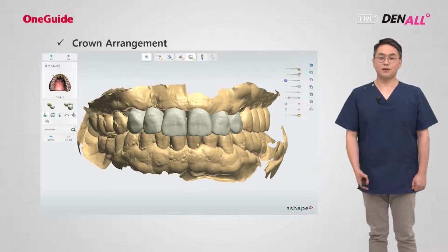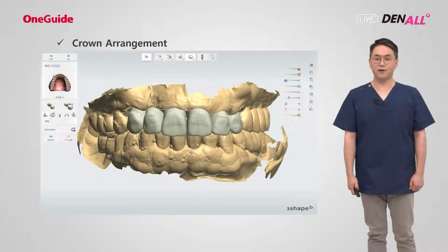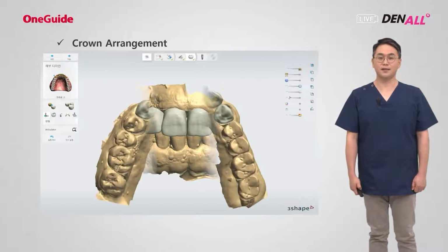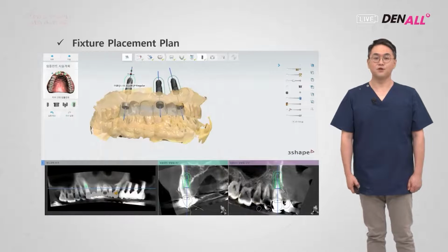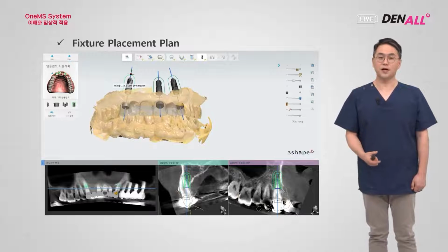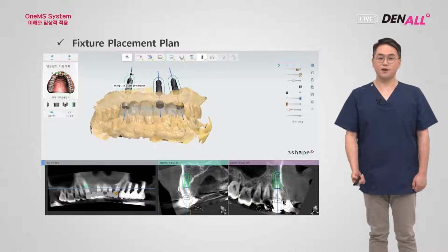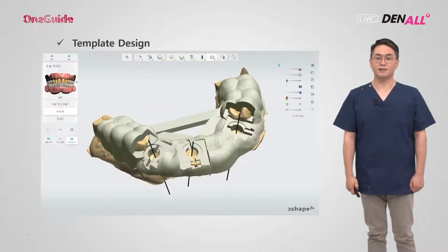To use the OneGuide system in the Implant Studio program, first, the ideal crown arrangement was done, so prosthesis design was done first. This is the top-down approach, as I explained before. On the occlusal plane, this is the arrangement. And based on that, to place the implant in the ideal position, ideal prostheses were designed, and to support that, on the CT image, implants were planned for ideal positioning. So 3 implants were planned on both sides, number 3, and on one side, number 21, where the implant will go in.